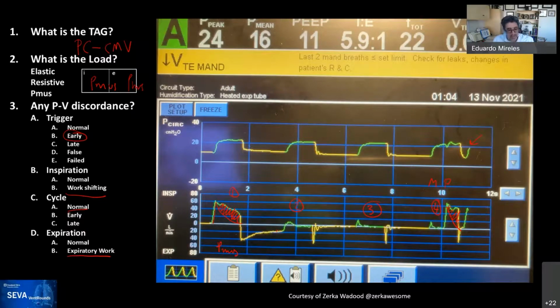Now, that last breath, it looks like the patient hasn't inhaled for about 4 or 5 seconds, and now, when he's finally done trying to exhale, he takes a big, huge inspiration, which is off the chart. You can't see it. Yeah. It could have maybe triggered this thing 2 or 3 times, right? Mm-hmm. That would have been interesting to see if the time scale was more to the right. And again, this would be similar to the prior patient, the patients that have neurological injury or patients that have issues with toxicity.